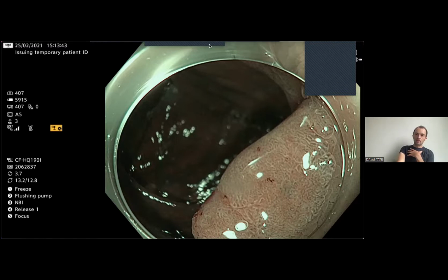And he's going to show us just now what we found. With all these, we've mixed them with pathology results, so you can see exactly what the pathology of these polyps was as well. So you can't say that we are messing around with our endoscopic imaging. We're correlating everything we do with histopathology.